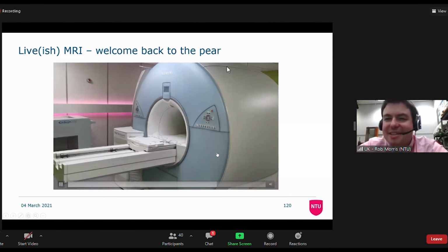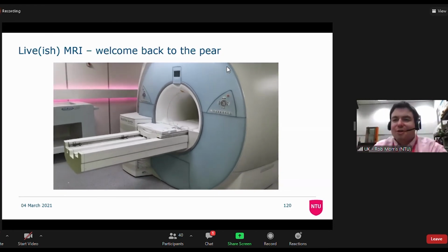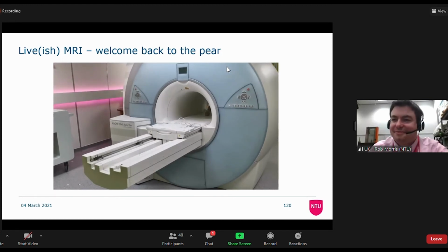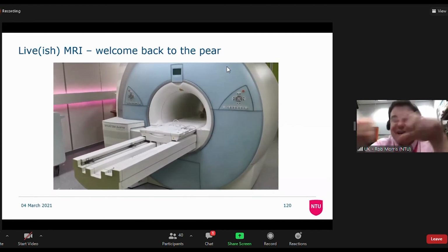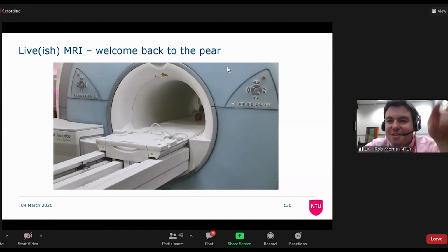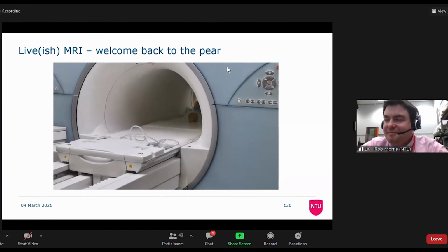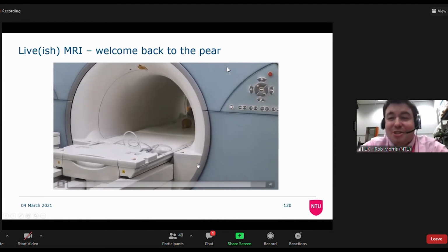Okay, that's the DICO test, so that makes sure that everything's okay. That then sets up one more spatial calibration for the coils, and then it will run our actual scan. So each one of those is a little segment of K-space that it's collecting for its excitation. And you can hear it thump. So the gradients, whilst they're on, knock against the side and make the noise. And then it will do that until it collects the image.